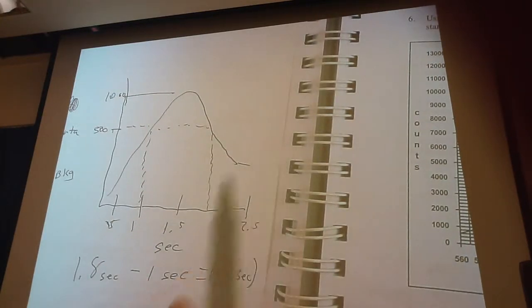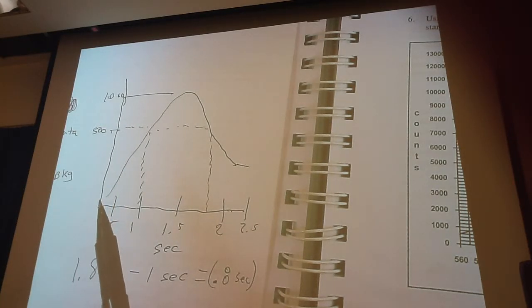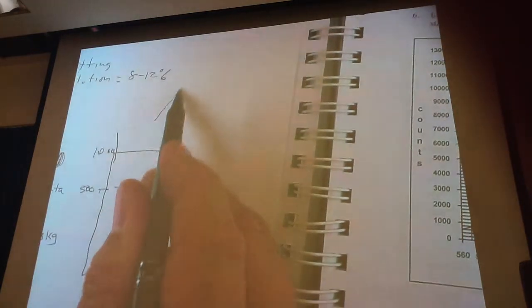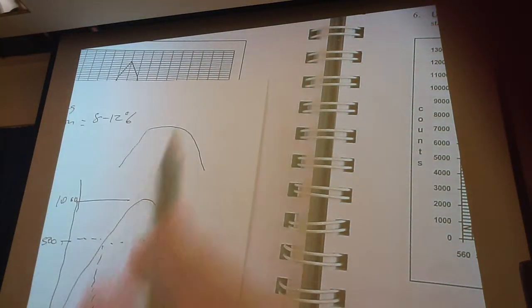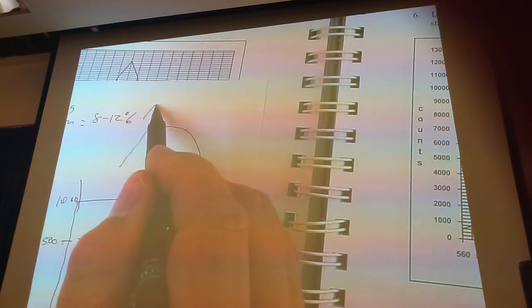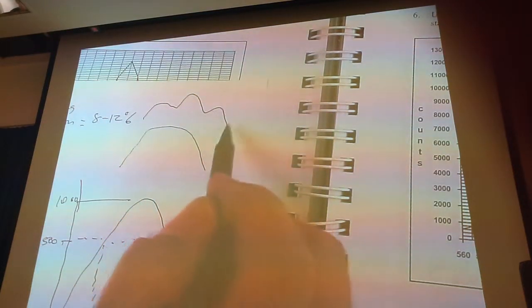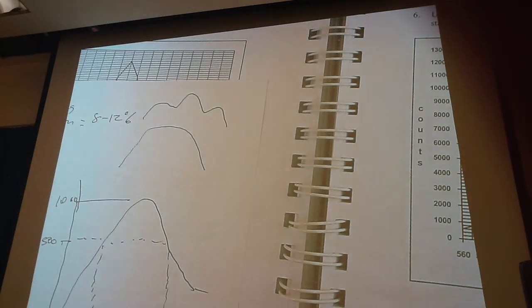The other thing is if somebody had, let's say, 20 millicuries, but it was in 3 ml, okay, it takes a long time to inject 3 ml, so what would happen is you'd see a wider peak in here. Okay? Or if they start and stop, what they call stuttering. They start injecting it, they're not sure if it got in, so they stop and then they re-inject some more. So they start and stop. You can analyze a bolus and see whether or not it's something you can use.